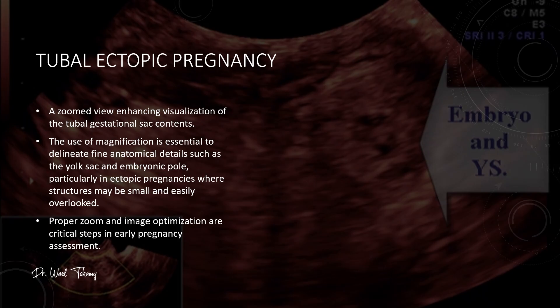Here is a zoomed-in view of the tubal gestational sac. By using magnification, we can clearly make out the finer details like the yolk sac and the tiny embryonic pole. In ectopic pregnancy, these structures can be very small and easy to miss, so proper zoom and meticulous image optimization are absolutely essential. Always take the time to magnify a suspicious area — here it can be the difference between spotting an ectopic early and missing it altogether.